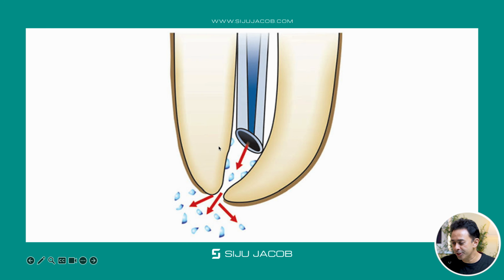The reason why extrusion happens is when one jams the needle into the canal, then the rest of the canal acts as an extension of this needle. So the needle is jammed tight in the canal, and then when the clinician exerts pressure and the irrigant is introduced into the canal, the rest of the canal will act as an extension of this needle, and the hypochlorite gets extruded into the periapical tissues. So this is the reason for extrusion.